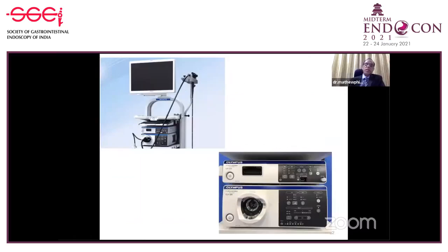Next slide. So what you need is you need a 290 system for this. Fortunately, it is available in India since the last 1 year, and I am fortunate to get one of that 1 year back. Next slide.